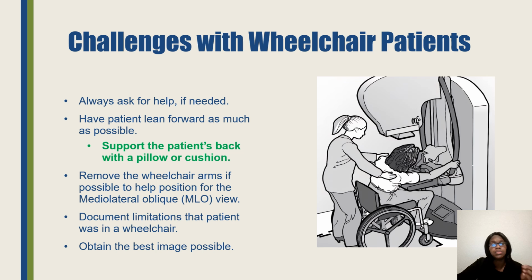And then if a patient is in a wheelchair, you can document that it was difficult positioning them because they're in a wheelchair. This is just an example of how you can position a patient, especially if you're not as comfortable with handling patients in a wheelchair. Always provide a pillow or a cushion behind their back, especially to get them a little more upright, and then try to get the best images possible. Call for help before the patient leaves, especially since they're in a wheelchair. Ask the radiologist if they need you to repeat the images, or if it's okay.